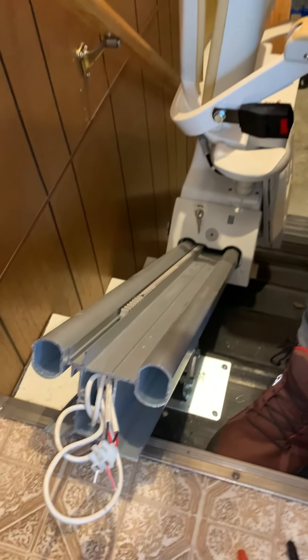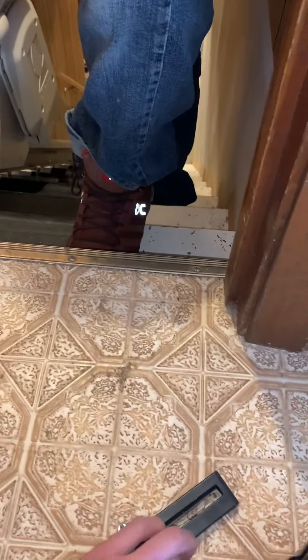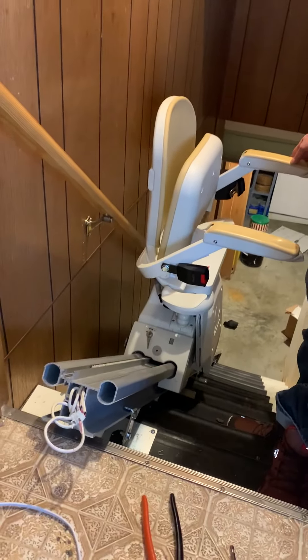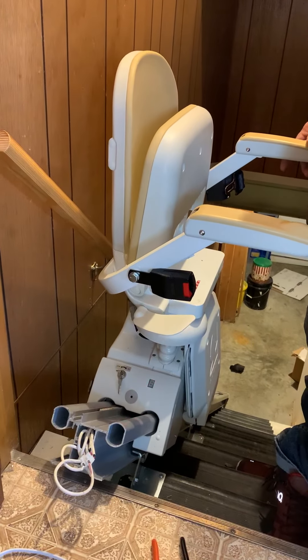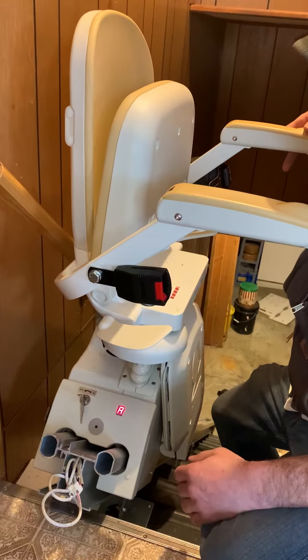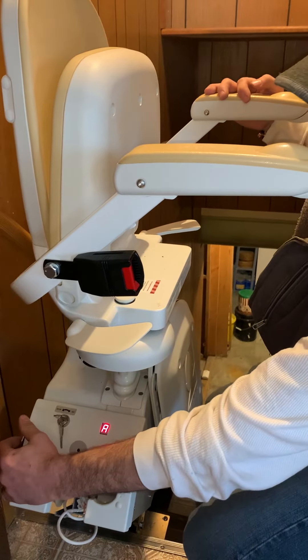And then what we do is we'll just run the chair up. Now the chair is going to start jumping a little bit, but it's not going to come off the track. There we go. Now power it off.